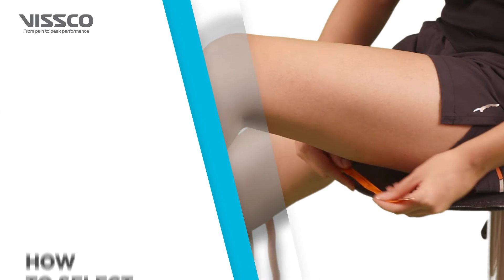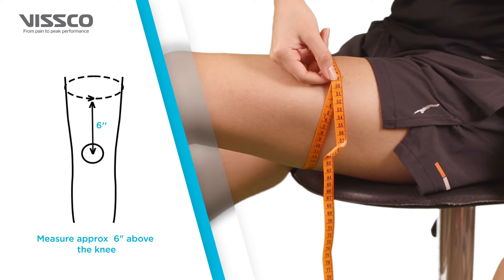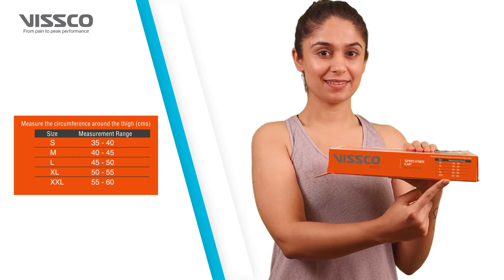For the product to be most effective, it is important to select the right size. Take a measuring tape and measure the circumference around the thigh. You can then select the appropriate size from the chart on the box.